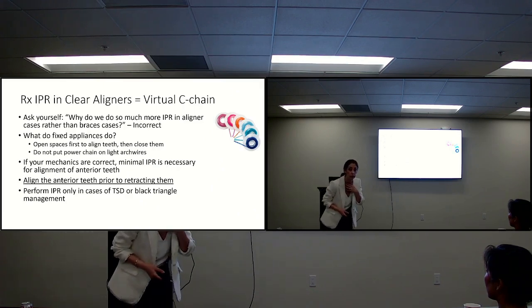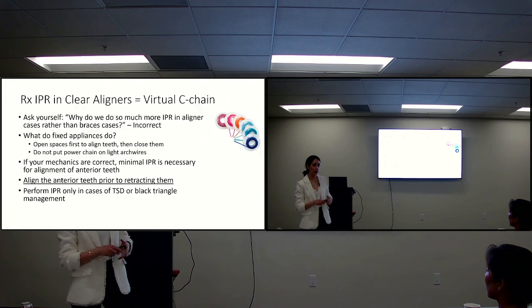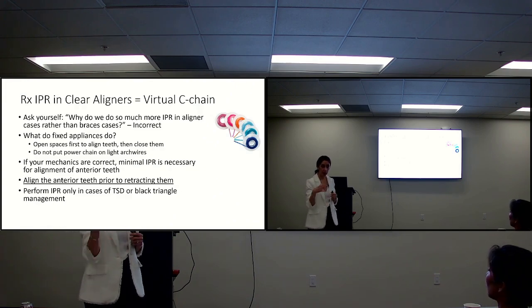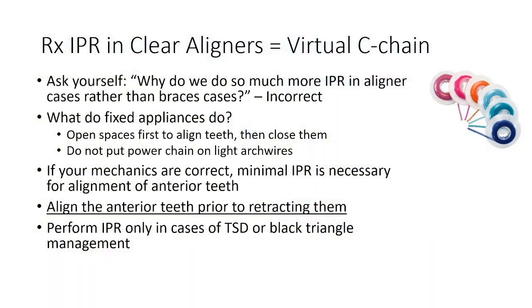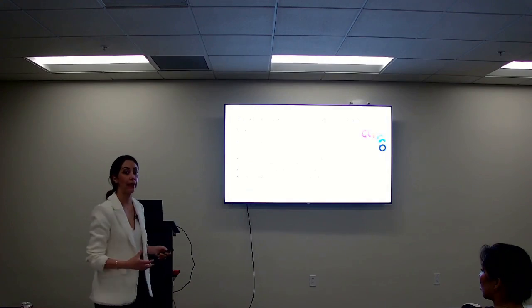You mentioned IPP. What is that? So it's an individualized personal plan or something. With Invisalign, I actually don't know if it's available to GPs. It's basically you tell Align your recipe, how you like to do things, and then they develop an algorithm so that all your ClinChecks come back with that algorithm.